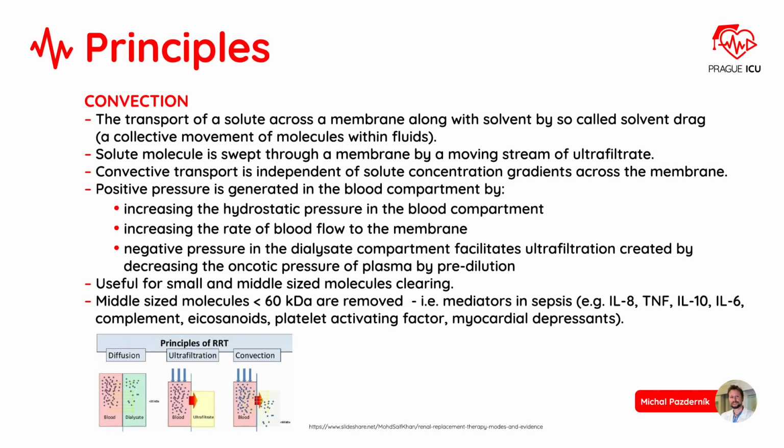Convection is the transport of a solute across the membrane along with solvent by so-called solvent drag, a collective movement of molecules within fluids. Solute molecule is swept through a membrane by a moving stream of ultrafiltrate. Convective transport is independent of solute concentration gradient across the membrane.